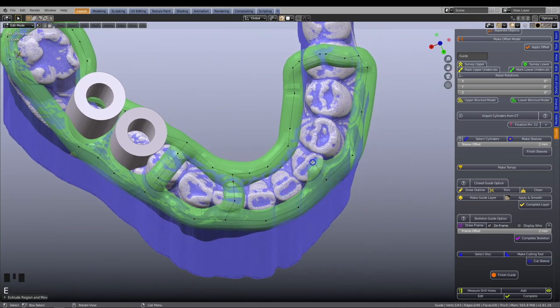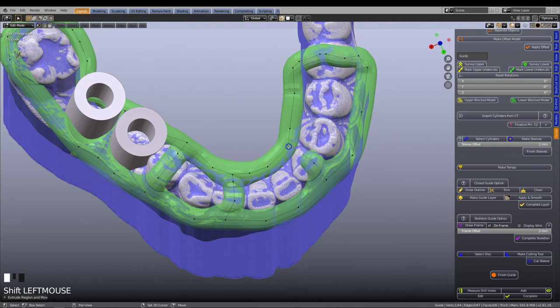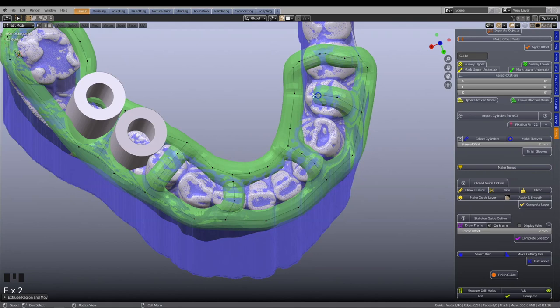Again, avoid the embrasures and rather construct the joins over the midsection of the teeth. We will design one more support structure over here.